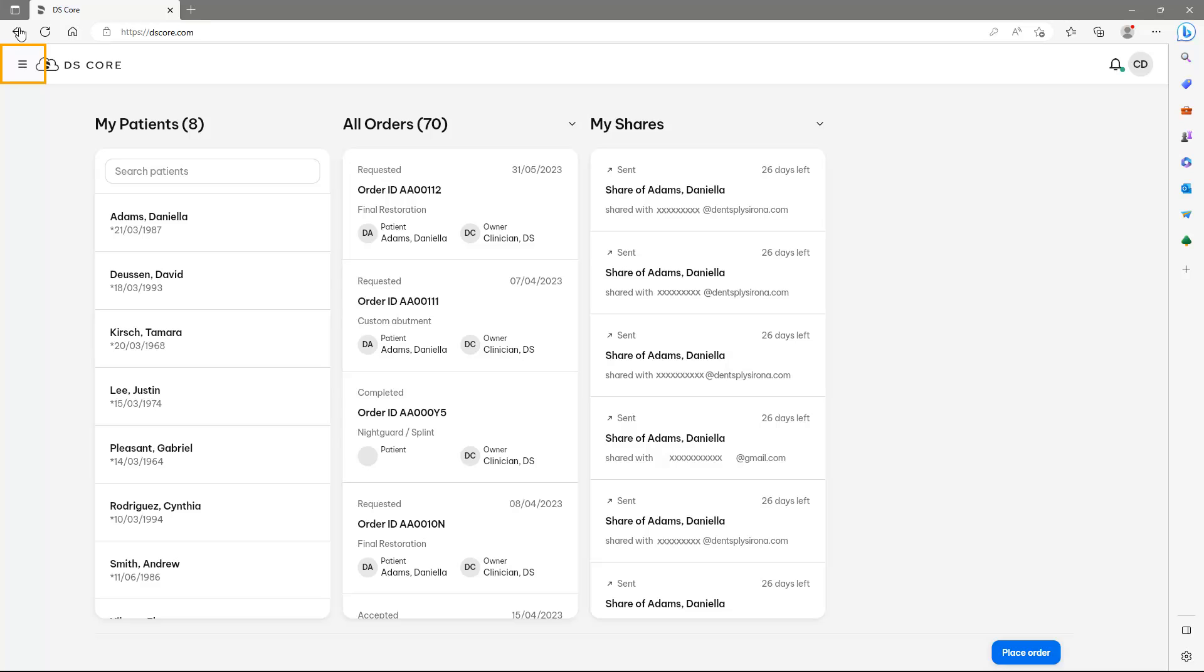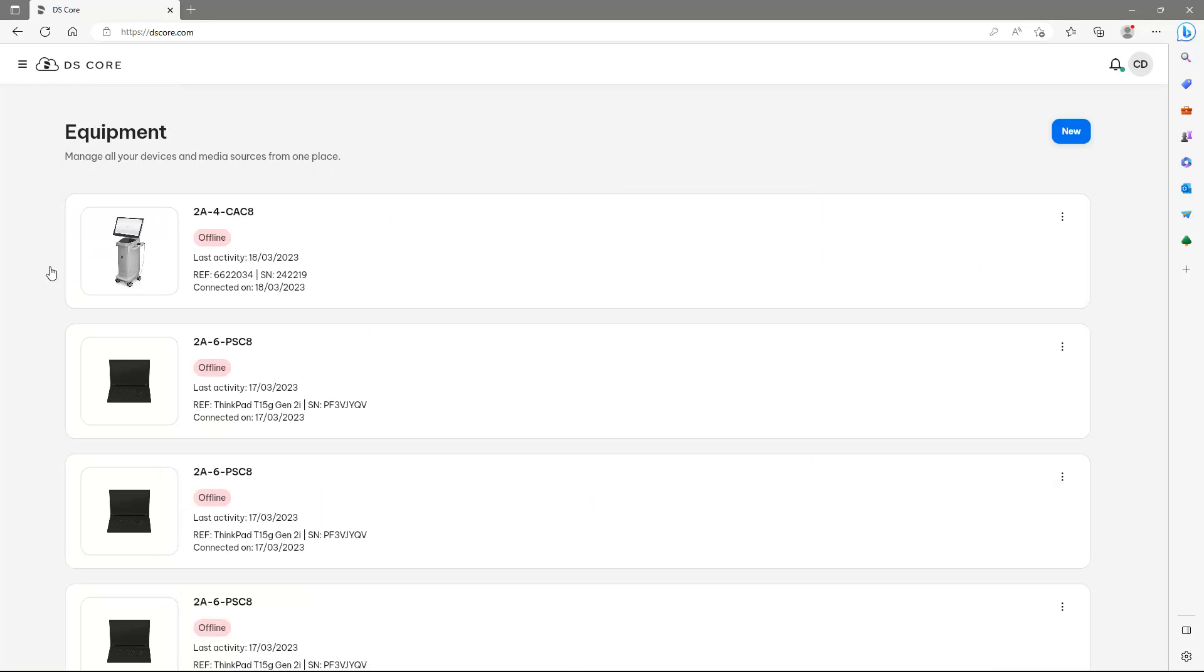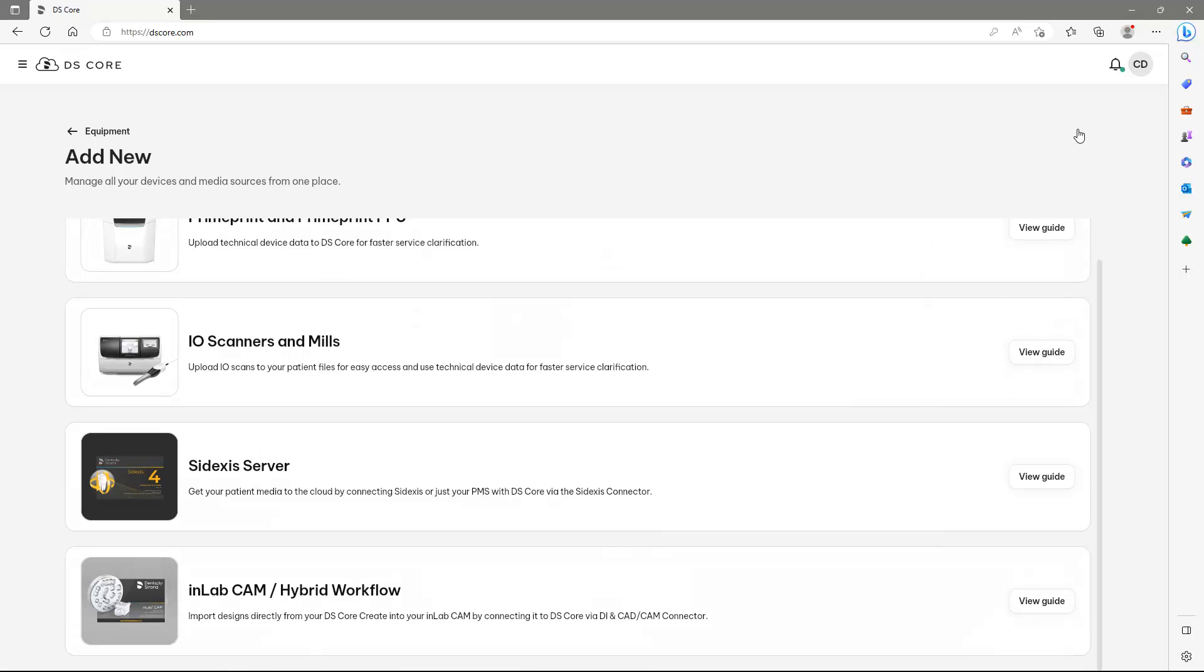First, we will open the menu and tap on Equipment. Now we tap on New, scrolling down, and choose in the last column, InLab CAM Hybrid workflow, the option View Guide.